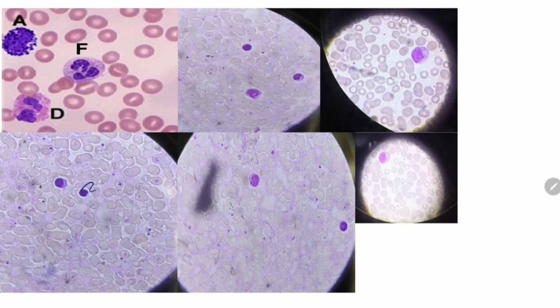See, this is the small lymphocyte. Again, try to see: this is the size of an RBC. So this is 2 RBCs, maybe. Suppose this is 1 RBC and this is 1 lymphocyte. So the size is almost similar, and slightly, the cytoplasm is here, clear cytoplasm.